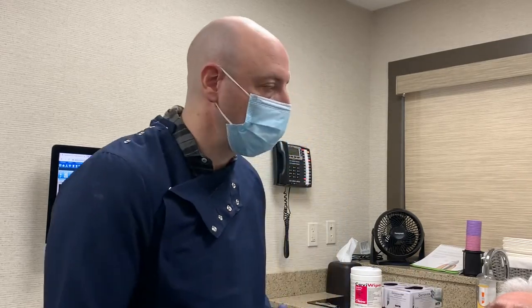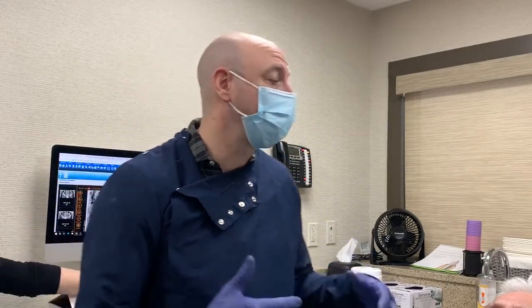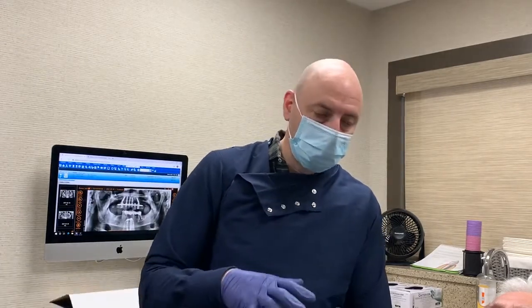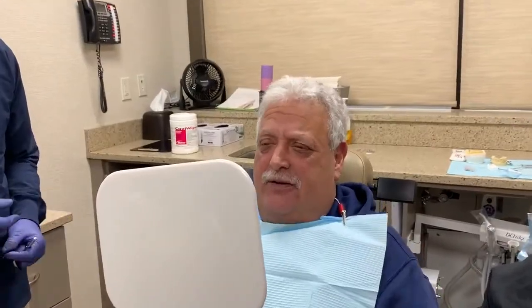So the good thing for Jack is that, again, we took our time to get the clear dupe mock-up in the right position, and our aesthetics are really, really tight, and our midline's on, and everything looks great, except for a minor occlusal adjustment. And that is standard because an articulator or a virtual articulator is never as accurate and dynamic as what a patient is able to recreate. So I always like to have a live try-in. And when we deliver it, we're still going to probably have to make a couple of occlusal adjustments, but that's normal. All right? That's a nice mouth.